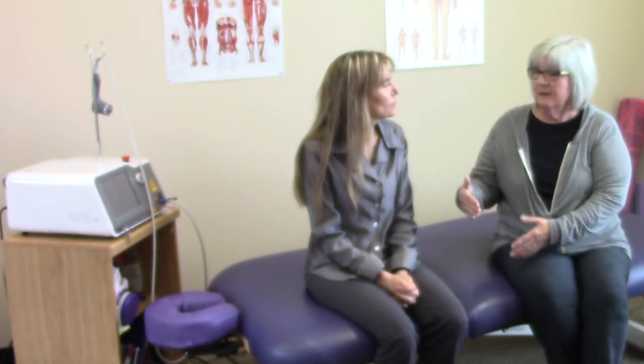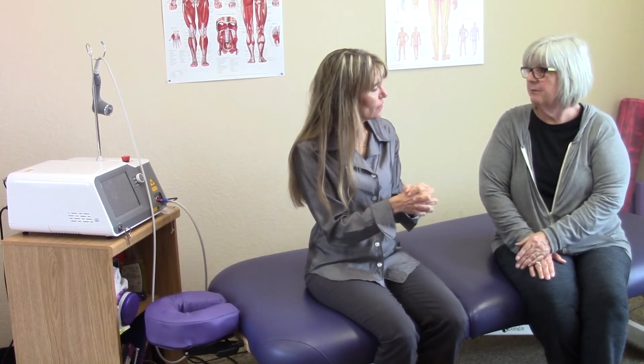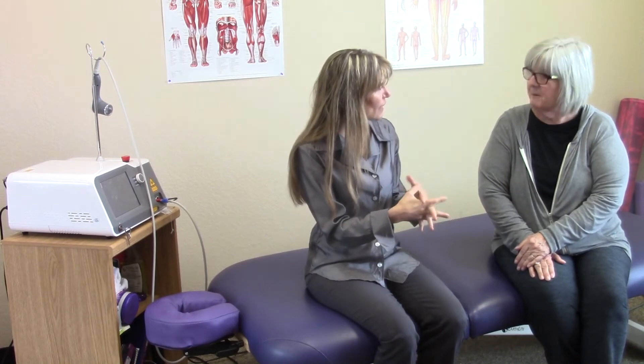So it improved with physical therapy — I was feeling an improvement — but with the laser, it was instant. Before you had the laser treatment, what was your pain level? Nine, ten. And then we did about a ten minute laser treatment on it, and you were... zero pain.